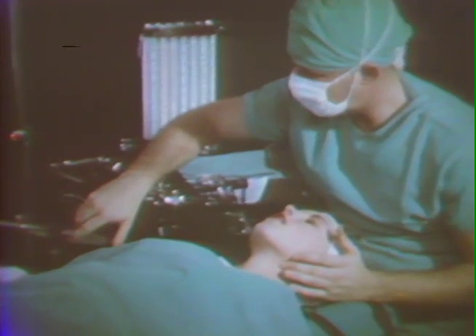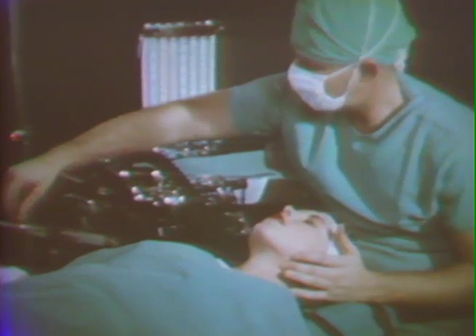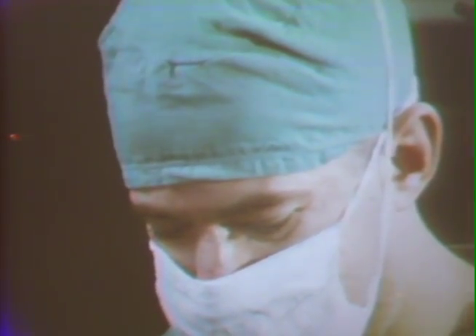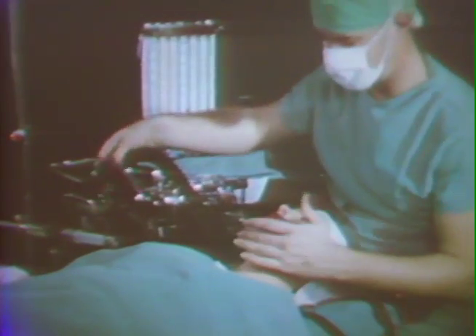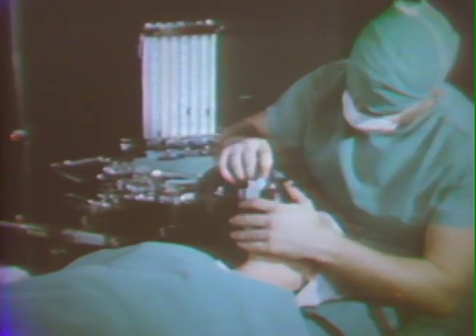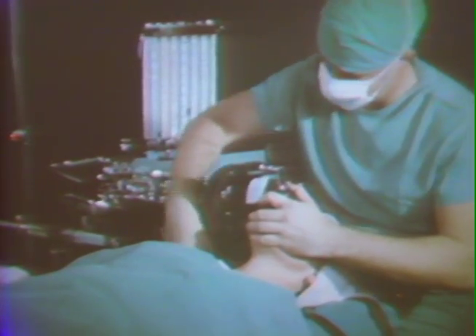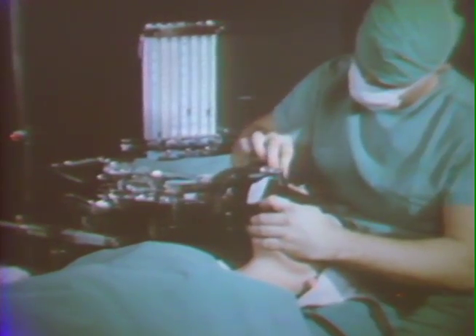A sleep dose of thiopental sodium is given intravenously. Following the induction of sleep, a flow of oxygen and nitrous oxide is passed through the halothane vaporizer and into the anesthesia circuit. It is important that a tight fit of the face mask be established and maintained. A face mask leak, requiring constant filling of the circuit with oxygen, dilutes the anesthetic mixture and delays the onset of anesthesia.